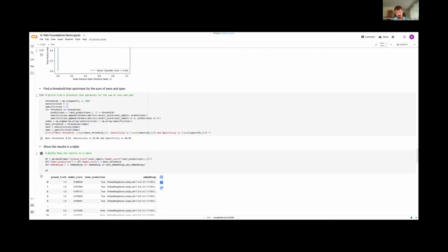So the range of potential applications is very large. It can be really clinical, like the cancer stuff, but it can also be quite banal, like is this a high quality image, or is this a lung tissue, for example? Those kind of things. It really depends on what is going to optimize your workflow. And what's really powerful about this is that you can build all those applications just from this single foundational model with minimal data.